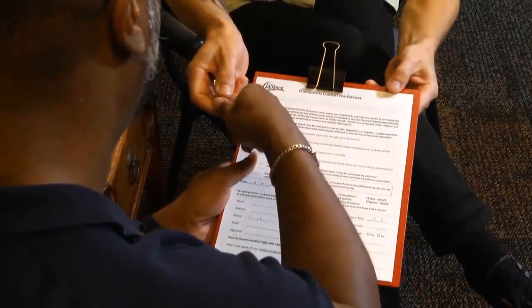Another thing I need to mention is that if the test comes back negative, depending on when the last time you may have been exposed to HIV, we may recommend that you come back to test again. But we can talk more about this while the test is developing. Okay, sure. So unless you have any other questions, I'm going to ask you to sign here, which tells us that you give us permission to test you and that I explained all this stuff to you. Here's a pen. Okay.